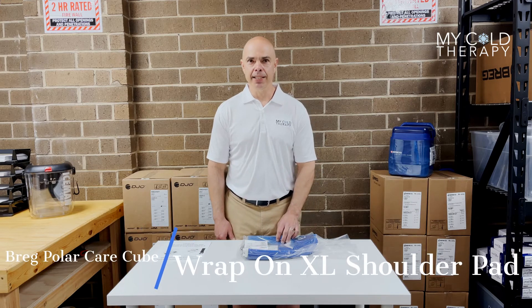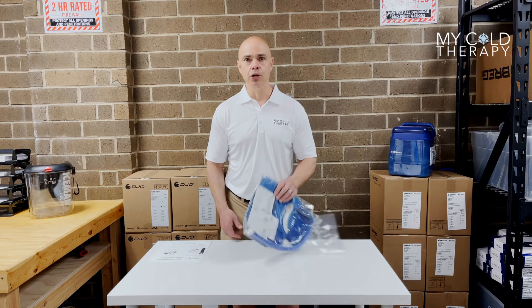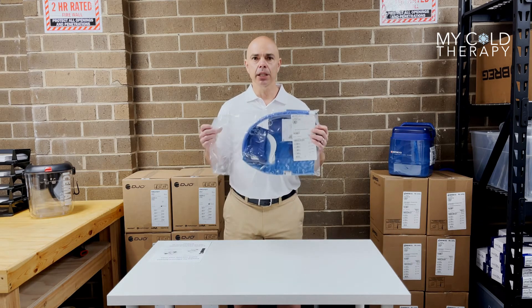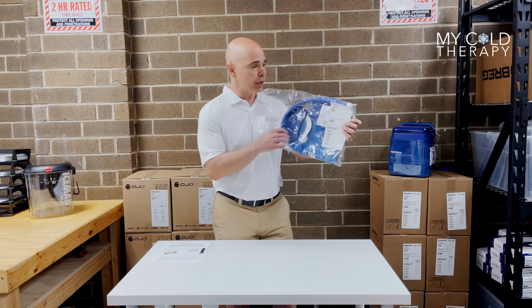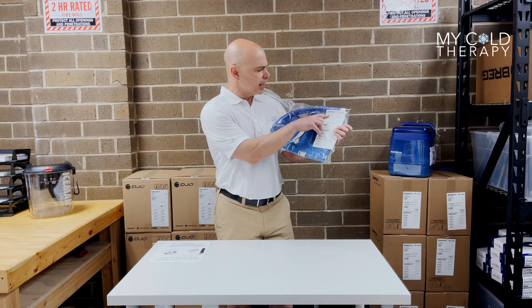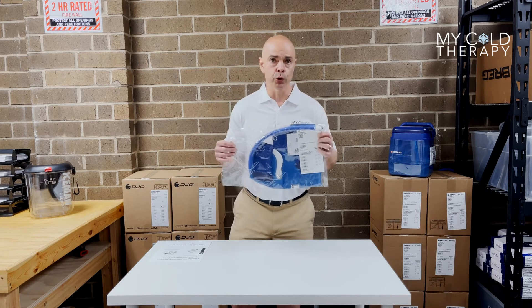Hi, my name is Steve from My Cold Therapy, and today we're going to talk about the Breg Polar Care Cube Wrap-On Extra Large Shoulder Pad. This is what it's going to look like when you get it in the mail from us. It's going to come in a sealed package. The first thing you want to do is check the part number — in this case it's 04905 for an extra large wrap-on shoulder pad.